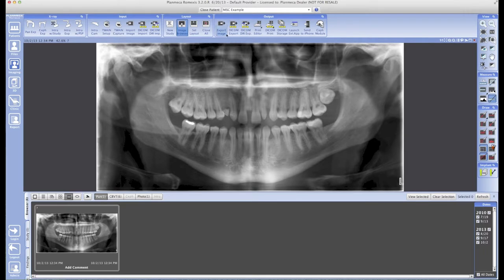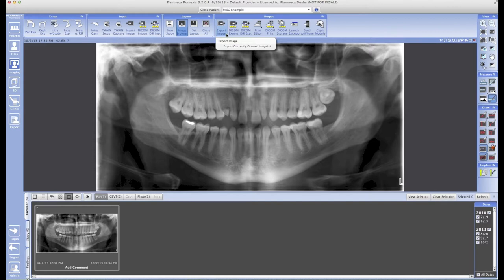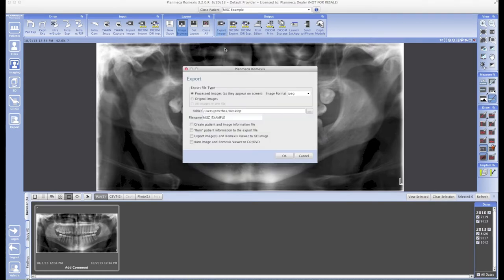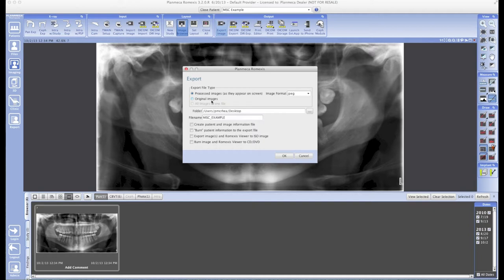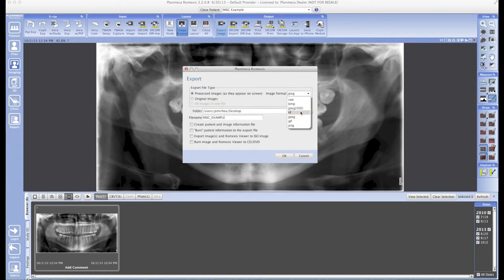I've got my patient and the image I want to export open. I'm going to go up top and click on this Export Image button, and it's going to give me this new window. This window gives us a few options. Usually you want to leave it at Processed Images and that JPEG file format, which is very common. This will give you the best image quality. If you choose Original Images, that's fine—it's just going to give you a more raw image without any contrast enhancements applied to it.